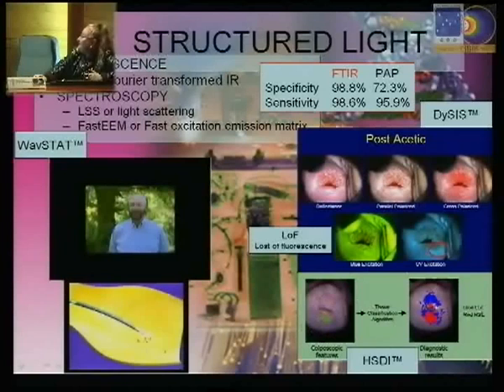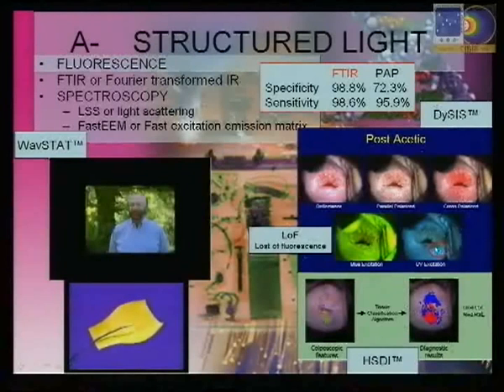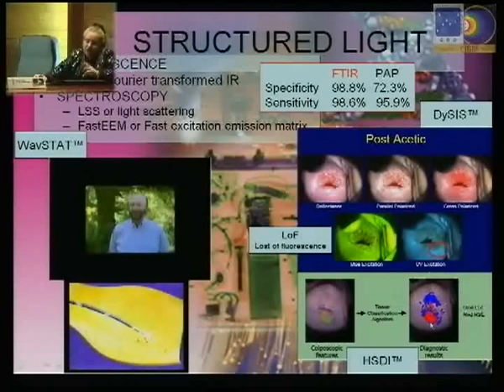Also, there are some intelligent systems, intelligent in that it is difficult to trust them unless you know exactly how they work, in which, combining all these technologies, they select not visually as you have seen in here, but electronically, the area of interest that you need to biopsy according to some strange, let's say, parameters which are inside of the device.